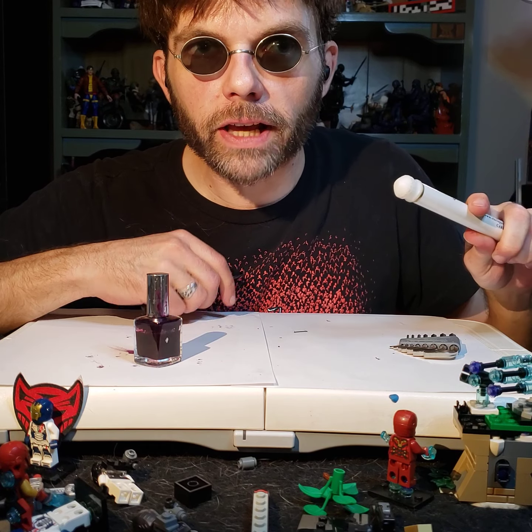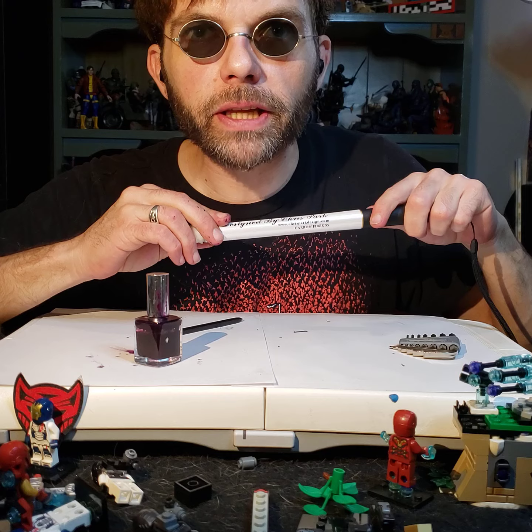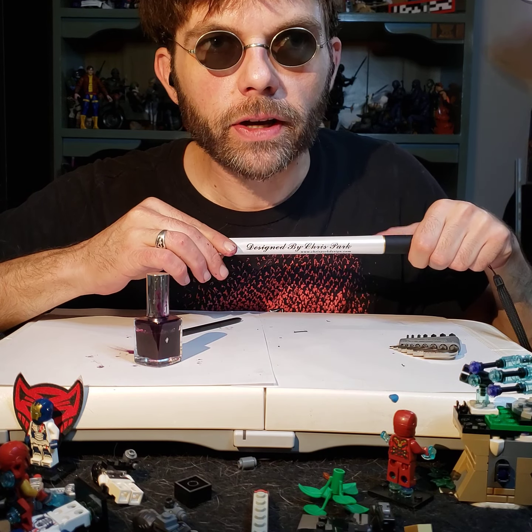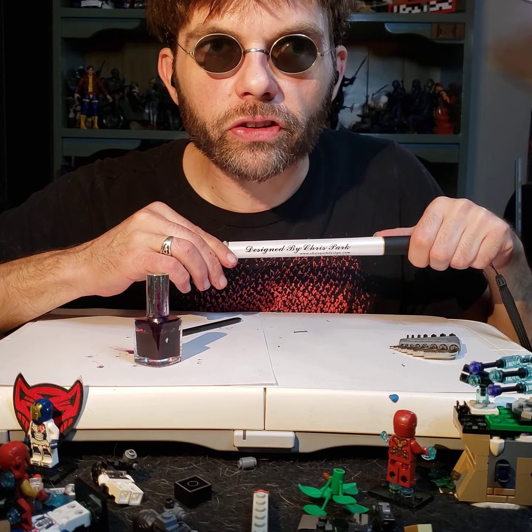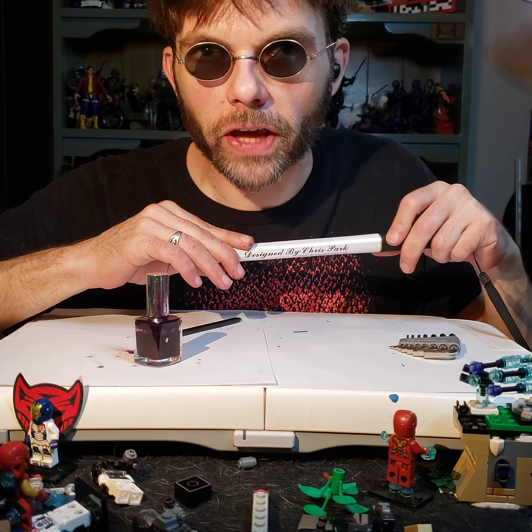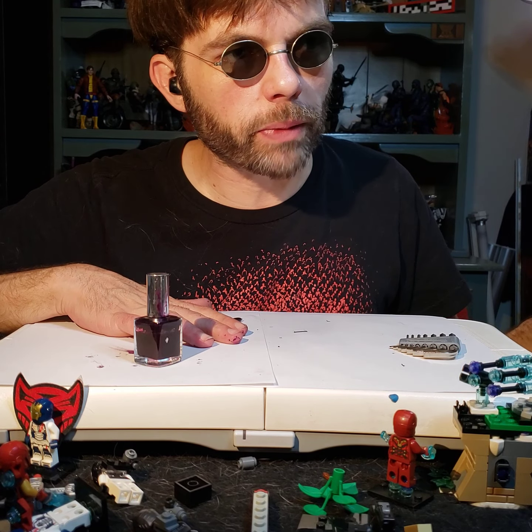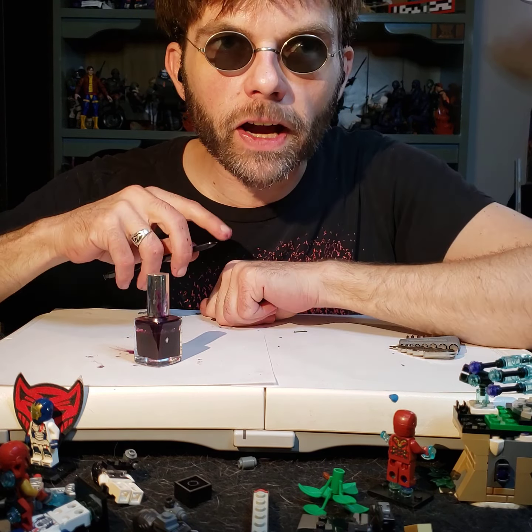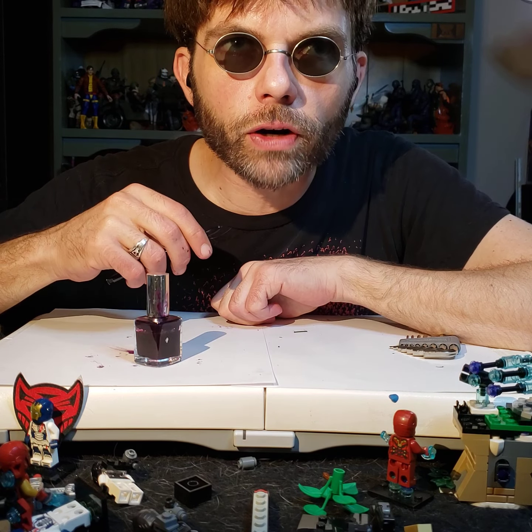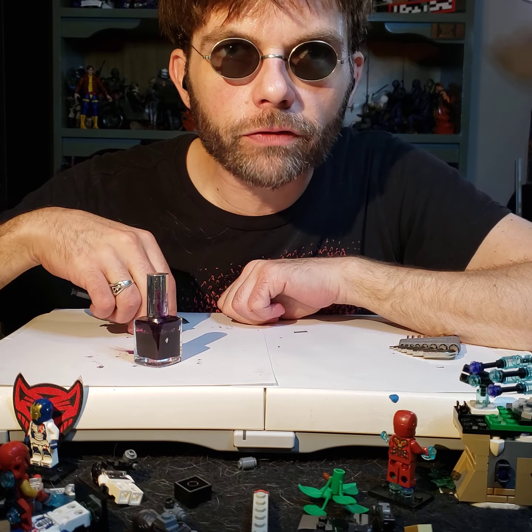But the pleasantness of it is if you get the same exact cane that you had before, all the other pieces are interchangeable. So once you have two canes, if a part of it cracks, you just now have a spare parts cane. And if any parts of your other cane crack that aren't the one that cracked on the first cane, you can easily switch out and repair. And that's what I've been doing for years with my carbon fiber collapsing canes, and I hope that you can do the same as well. Never throw these guys out, because you will never know when you're going to need to harvest them for parts.